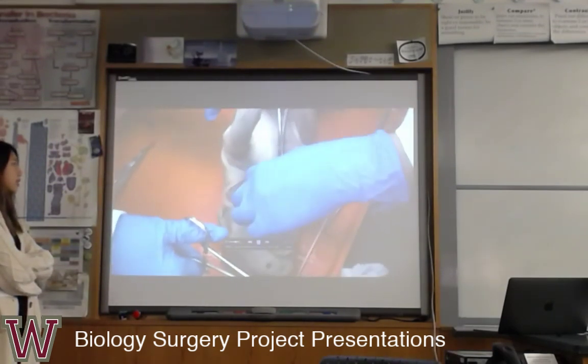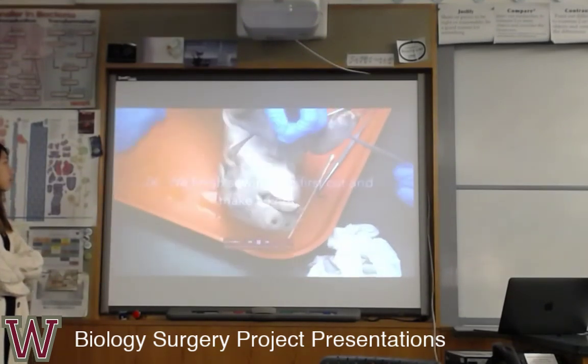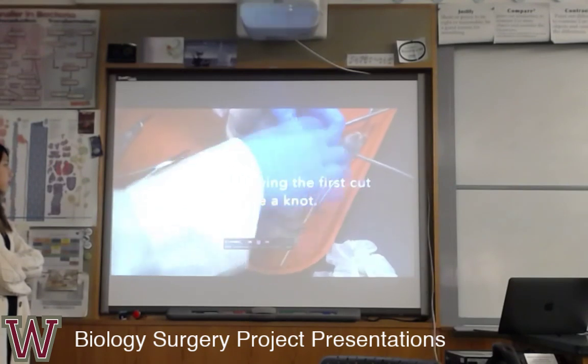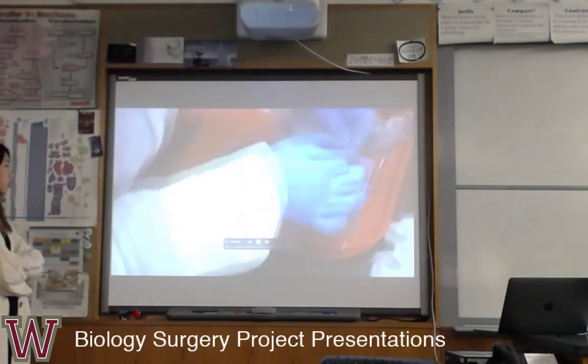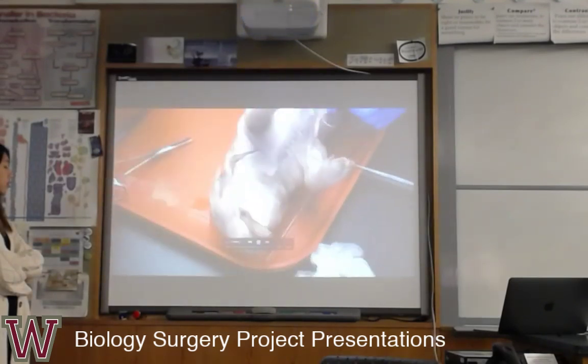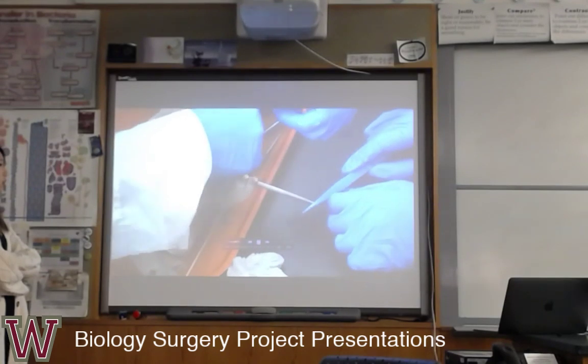So right now we're about to finish sewing the first cut, so we're going to make a knot. Also, there's a really hard thing: the surgeon used the scissors to make the knot, but after trying millions of times, we failed. So I just used my hands.